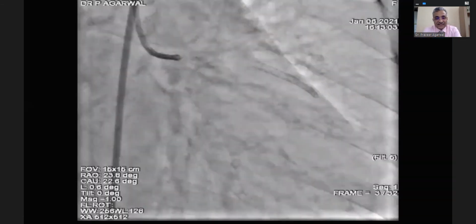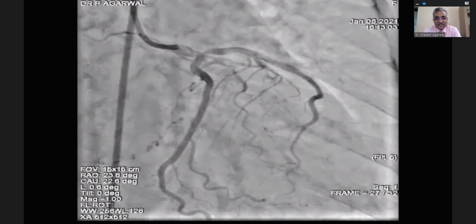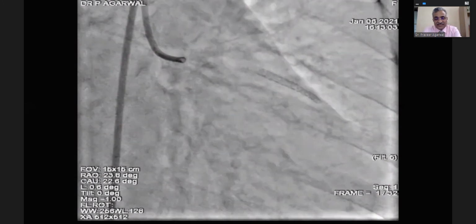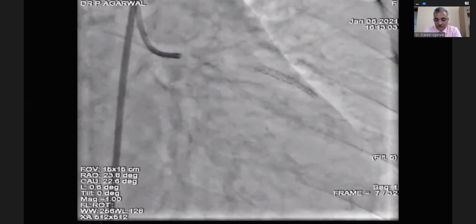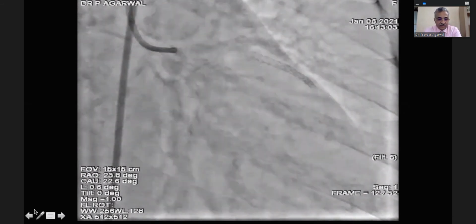Now see this lady. This lady comes with left main disease with ostial LAD disease. Previously she had angioplasty to mid LAD and the circumflex about 6 or 8 years back. She's doing all right. And now this is a lesion. This is a bad lesion, but the calcium is fine, and it's a fibrotic plaque that we know initially. So we took the initial run with the OCT.